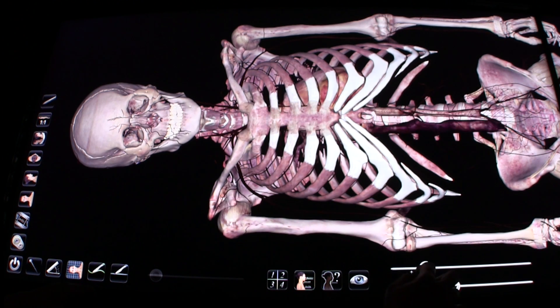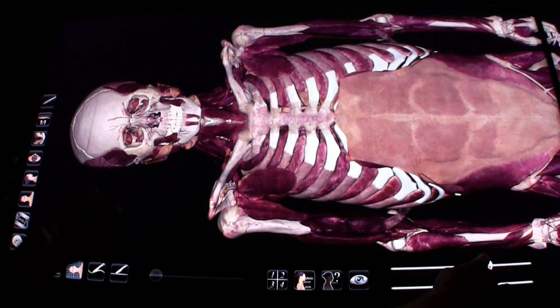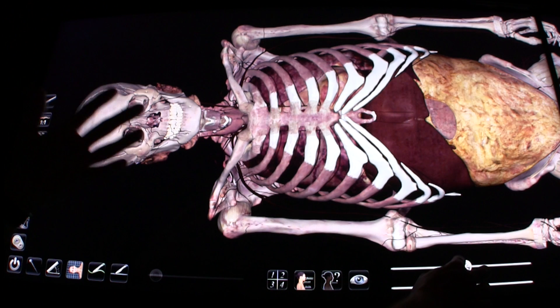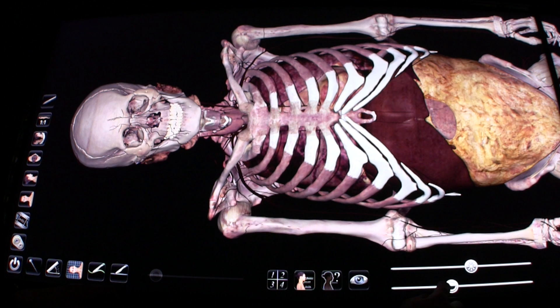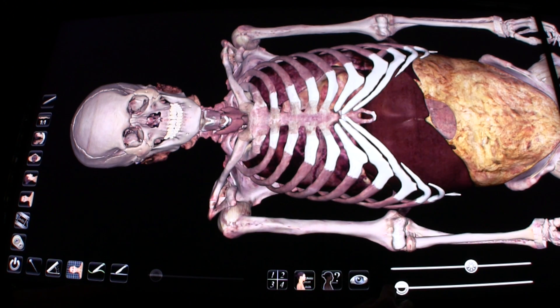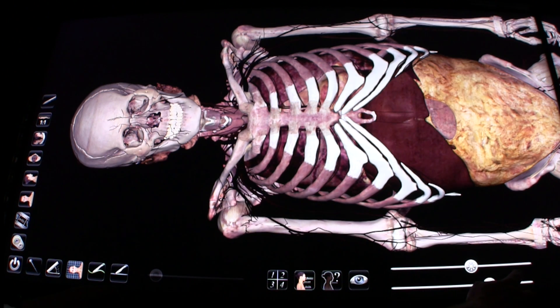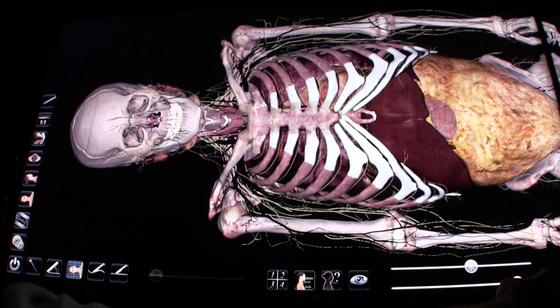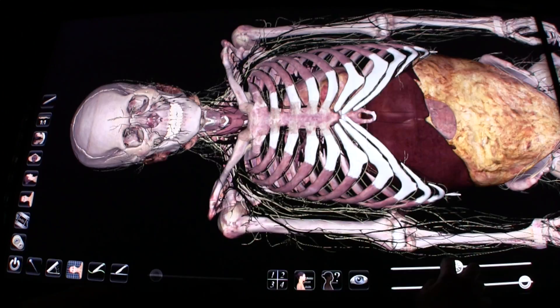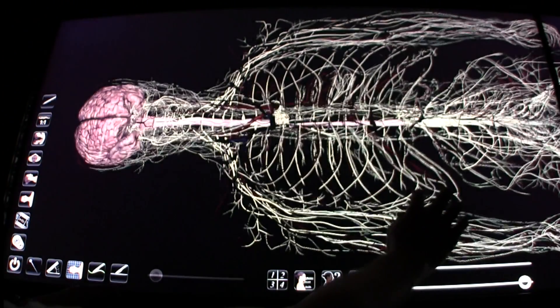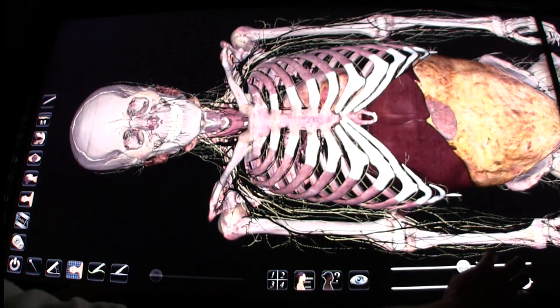Move it back to the right and it starts adding layers back. Now if you'd like a more customized view, there is a whole separate menu available where you can turn on or off very specific structures, organs, etc. The bottom slider is the contrast slider. If we move it all the way to the left and then back to the right, it starts to display the veins, nerves, and vessels. By using the two sliders together, you can get some really interesting unique views, and it's still completely three-dimensional and interactive.